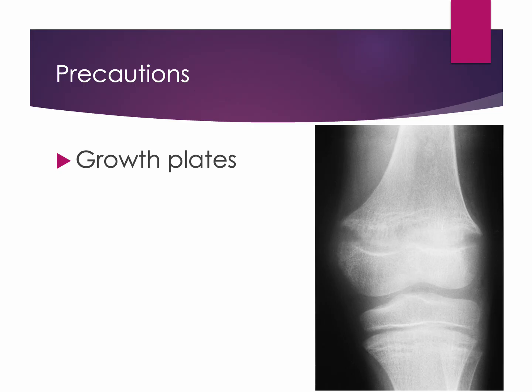Historically, animal studies suggested that high-intensity ultrasound exposure over growth plates could alter cellular activity and potentially affect normal bone growth. Although the evidence in humans is limited and the exact clinical risk is not fully established, clinicians are taught to use caution because growth plates contain rapidly dividing cells that may be more sensitive to thermal stress. For this reason, thermal level ultrasound is generally considered contraindicated directly over open growth plates, particularly when high intensities or prolonged treatment durations are used.